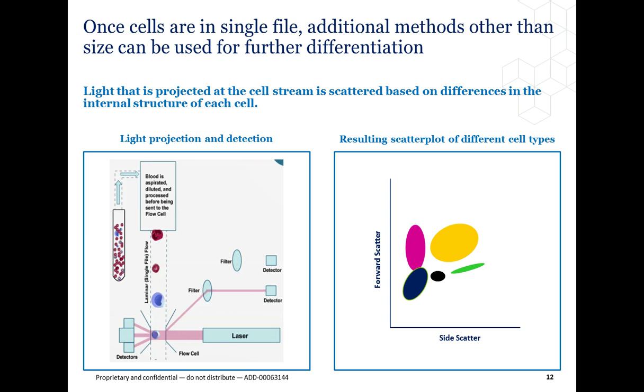Once the final event is recorded, this data is then evaluated by an algorithm, and all angles of light scatter per event are classified by their common characteristics. If abnormal cells are present, flagging of those populations is indicated and further follow-up is required, obviously, again, going back to the manual differential. Since there are usually more than 2 different scatter detectors, each detection signal can be graphically represented in the form of dots on a scatter plot, as seen on the right-hand side.